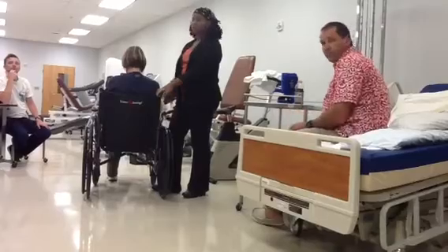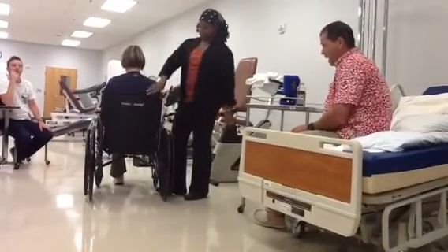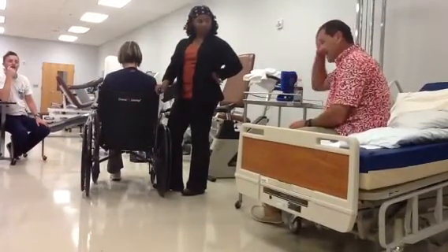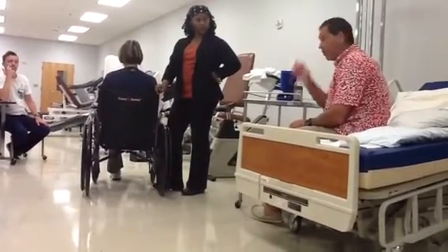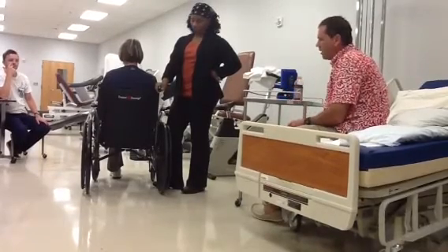Could you just put a cushion in the seat since she has such long legs? It's not going to hurt to be up a little bit more. And there actually would be a cushion in that, either a ROHO or some kind of pressure relieving device. That should make it about right.